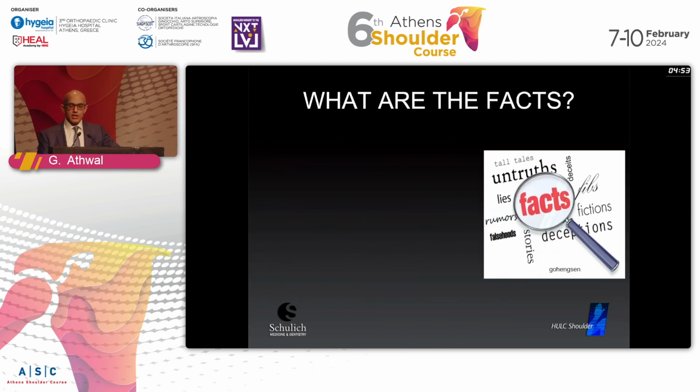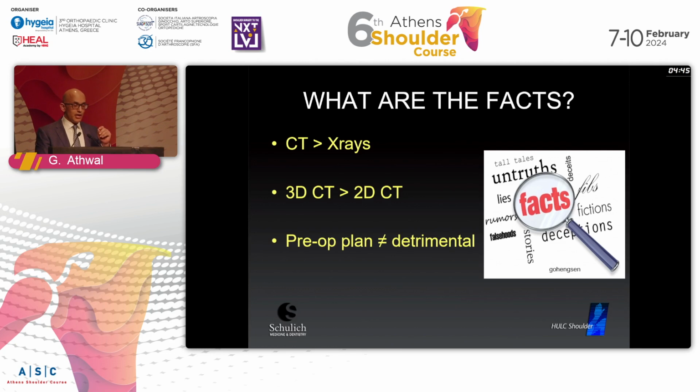So what are the facts when it comes to preoperative planning? We know that CT scans are better than x-rays. We know 3D CT scans are better than 2D CT scans. And we also know that thinking about an operation or planning has never been shown to be detrimental. It's only of benefit to you as the primary care provider and also to the patient.